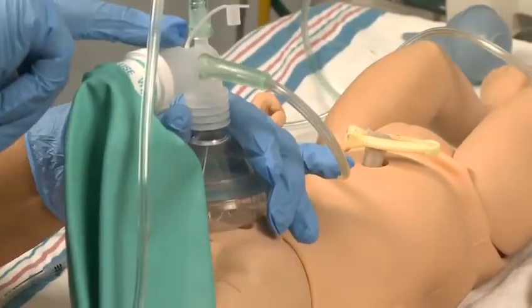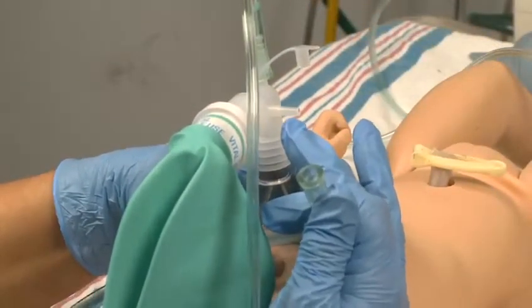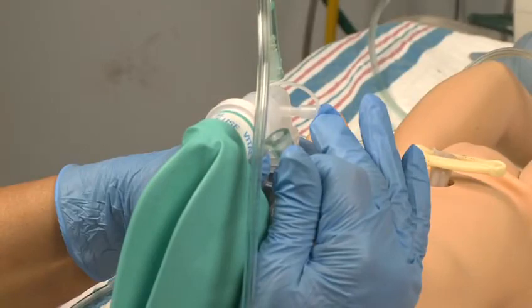If your flow inflating bag has a connecting site for a pressure gauge, a gauge must be attached to the site. If the gauge is absent, the attachment site must be occluded with a plug, or the site will be a source of leak and the bag will not inflate properly.